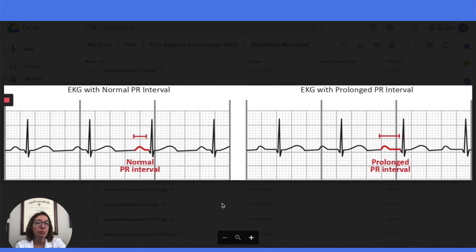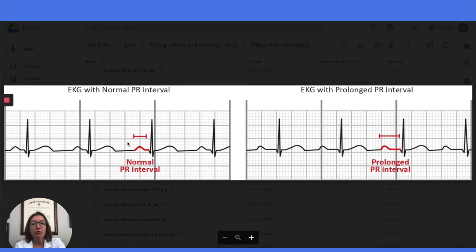The next step in EKG interpretation is analyzing the PR intervals on your strip. We want to use calipers to make sure we get an accurate measurement. The PR interval should be between 3 and 5 small boxes wide, which is 0.12 to 0.2 seconds in duration. You can see that the PR interval on the left is normal at 5 small boxes, as opposed to the interval on the right, which is prolonged — over 5 small boxes wide. You also want to make sure the intervals are consistent across the strip, as there are some dysrhythmias where the PR interval will gradually lengthen.